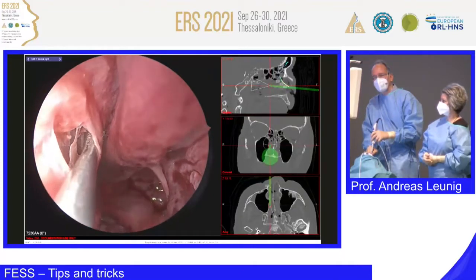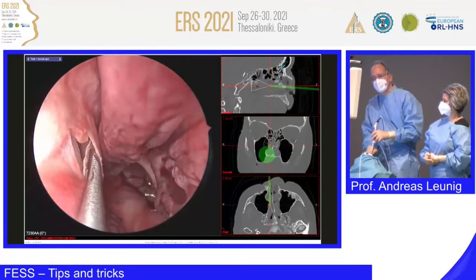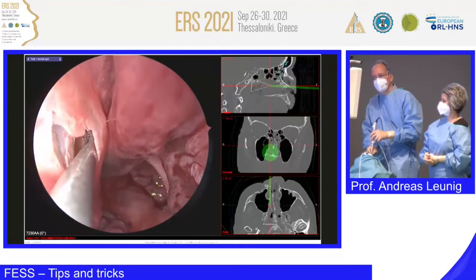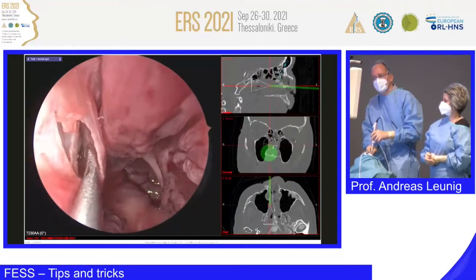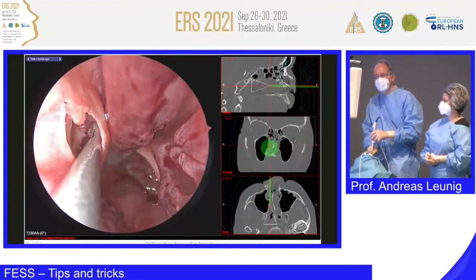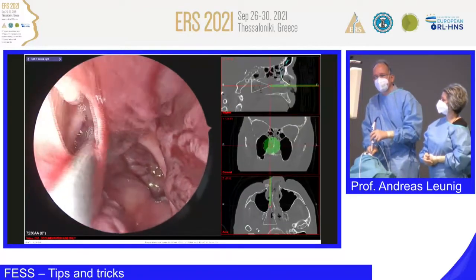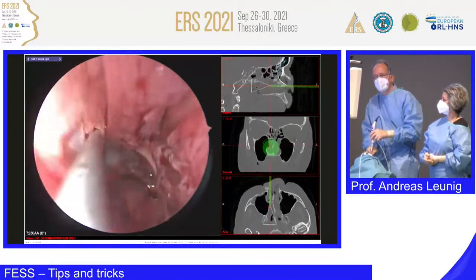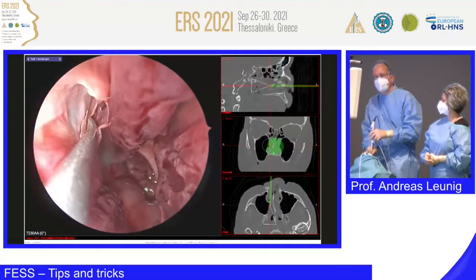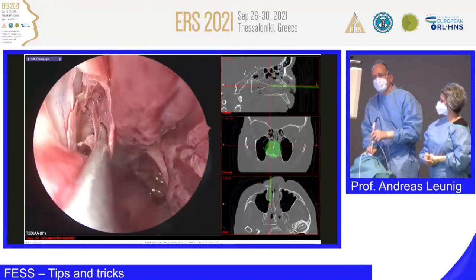And now we're going in, and hopefully I can demonstrate this in the right way. I'm going in, it's a very tiny bone here. And so what we are touching here is a reliable landmark. It's called Crista ethmoidalis, and the Crista ethmoidalis helps you in identifying and in seeing the artery. And now we are doing a little bit, it's very tiny bone here.